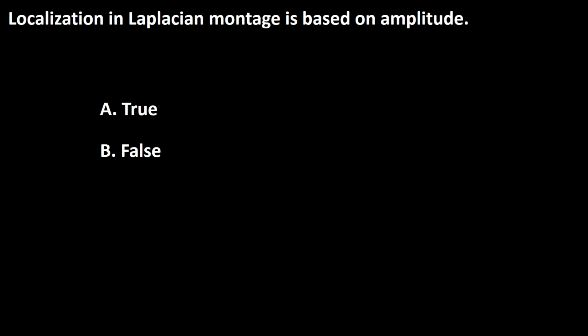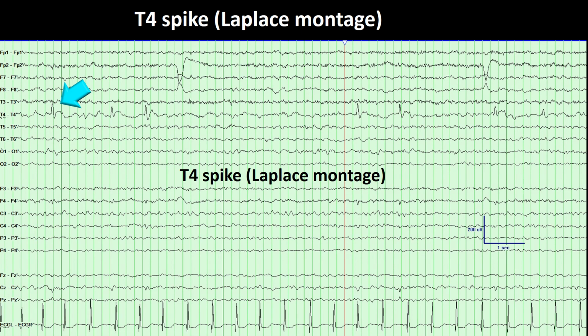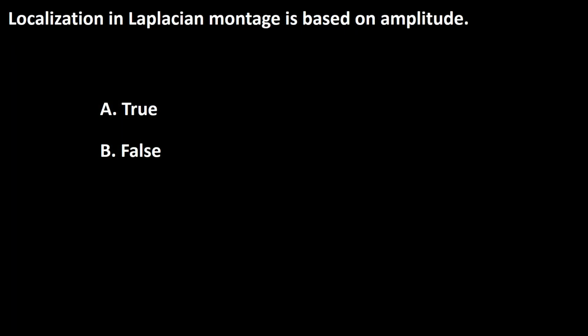Next question. Localization in Laplacian montage is based on amplitude. A true, B false. Localization using Laplacian montage is based on amplitude. The apostrophe in the second T4 implies neighboring electrodes. So the answer to this question is true.